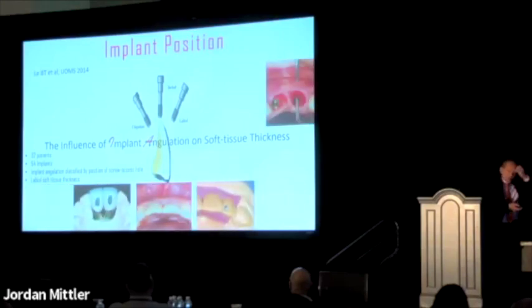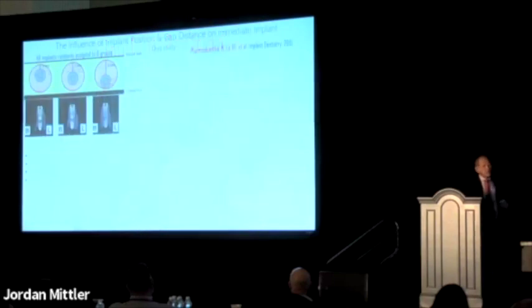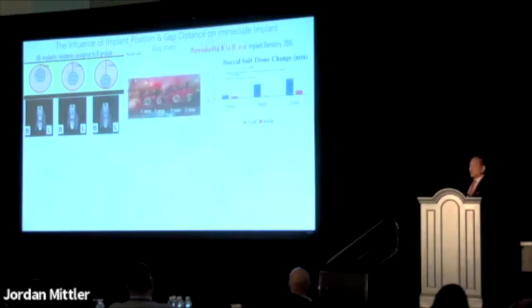And so we measured and did statistical analysis. What we found is that if an implant goes through the buccal, the tissue is about 1.5 millimeters. But in that same patient, if it goes out the cingulum, it's double. It's 3 millimeters in the same patient. Same thing in this animal study, placing implants in the center, the palatal or the buccal: the palatal placement had thicker bone, but also had thicker soft tissue.